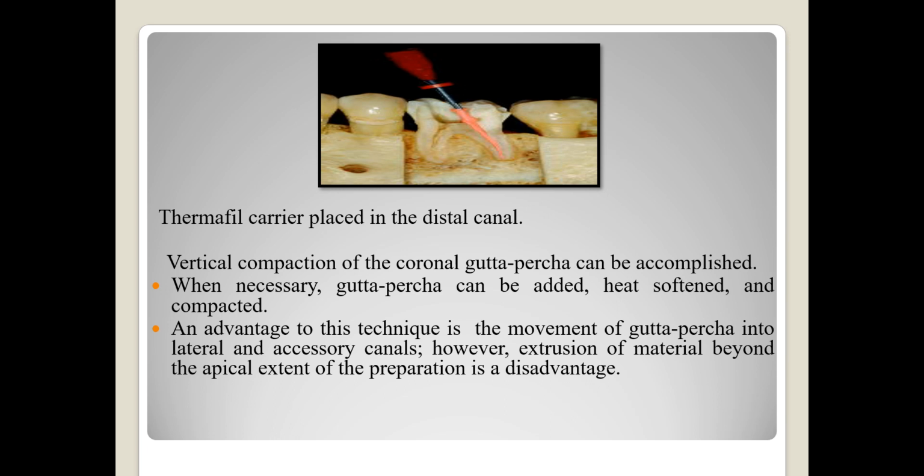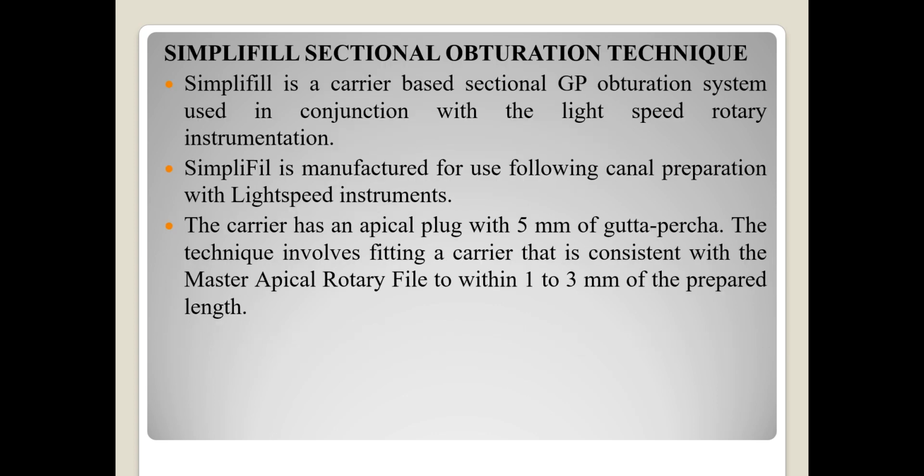An advantage to this technique is the movement of gutta percha into lateral and accessory canals. However, extrusion of material beyond the apical extent of the preparation is a disadvantage.